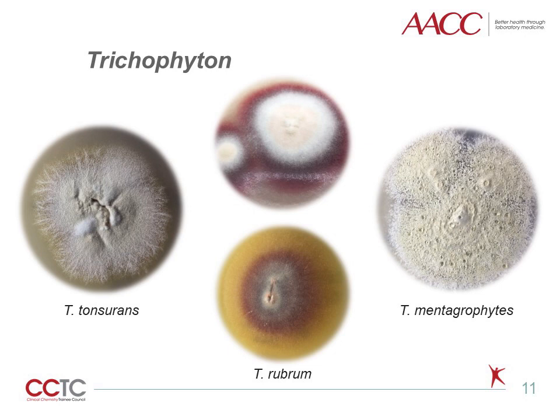It may also be helpful to take a look at the back of the plate, or the reverse, to note the colorations. If you have the opportunity, I would suggest visiting your microbiology lab to look at molds in person in order to appreciate their diverse morphologies.